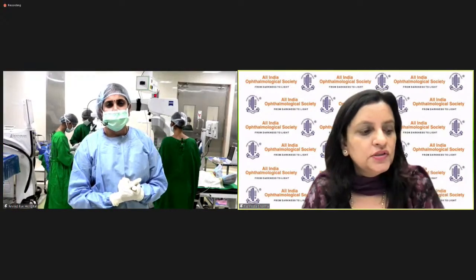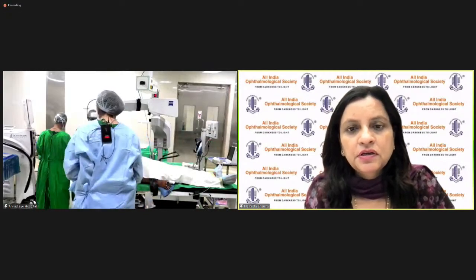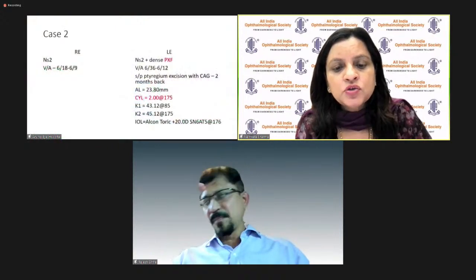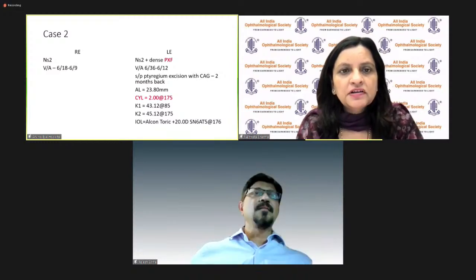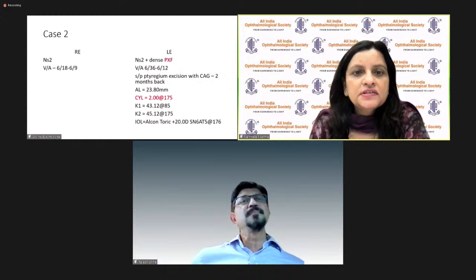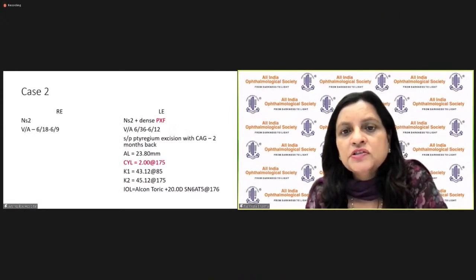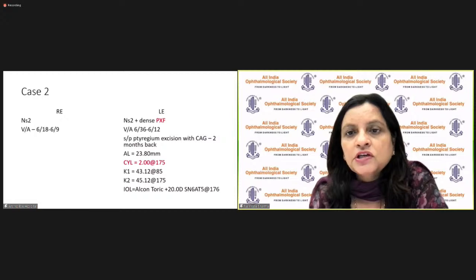Okay. So the second case that we are doing is, again, a phacoemulsification. You are doing case 2 now? Yeah. It's on the screen now. It's a dense cataract with pseudoexfoliation syndrome, with the pterygium excision, which had already been done previously with autoconj 2 months back.